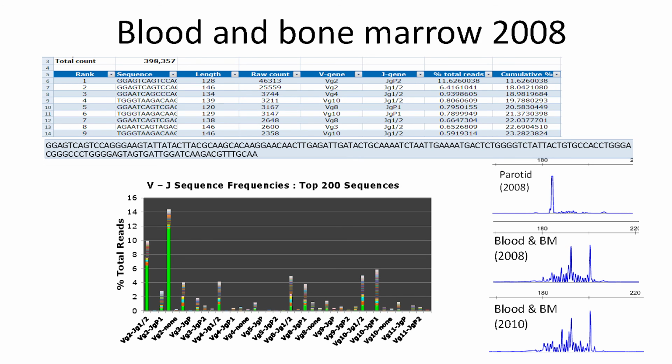In here, because there was a polyclonal background and these 2 peaks were different to that one, we just said, well, maybe this is just a pseudoclone. This is not a different lymphoma. But when you run the NGS assay, you know that it is a different clone with a completely different sequence.